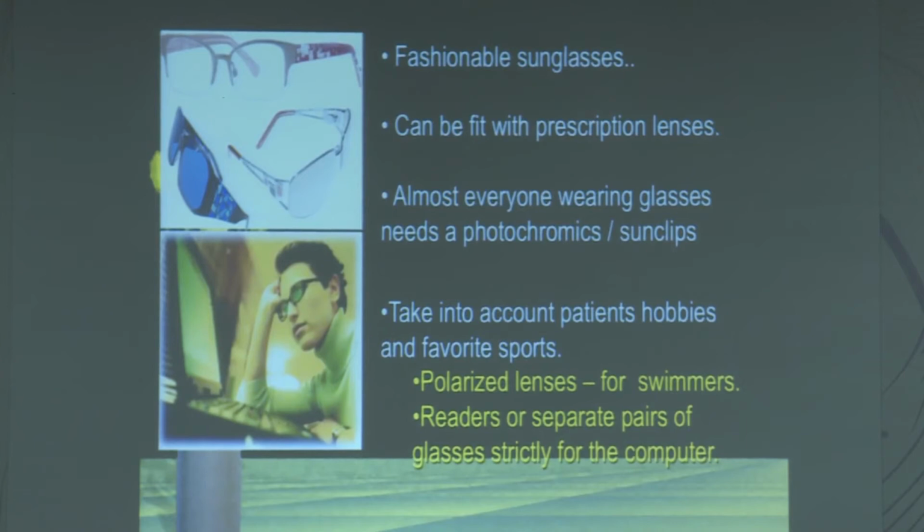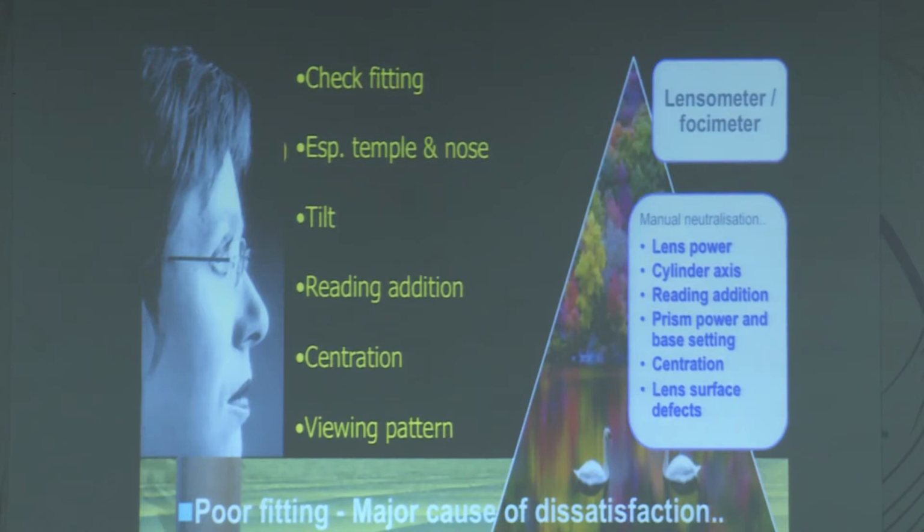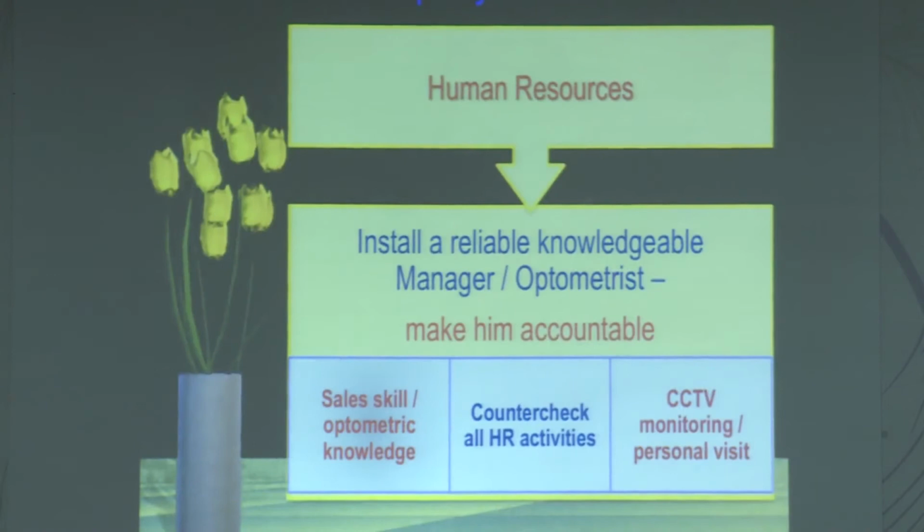But as a doctor, what you can do extra is this part, post-fitting verification, very, very important. Check the fitting, have some quality checking on the frames: the pantoscopic tilt, the reading addition, centration, viewing pattern. Poor fitting is one major cause of dissatisfaction. If you can take care of this part, you'll really score over all the online retailers as well as the non-ophthalmic optometric outlet.